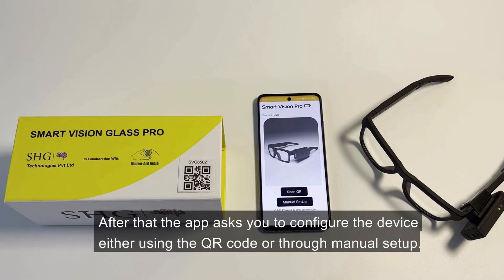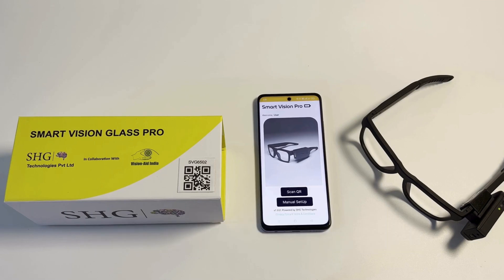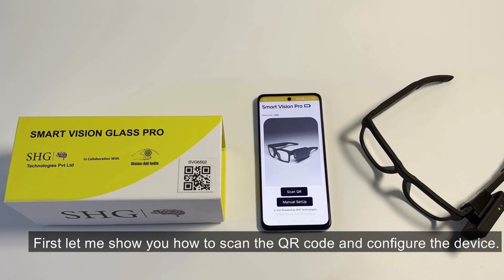After that, the app asks you to configure the device either using the QR code or through manual setup. First, let me show you how to scan the QR code and configure the device.